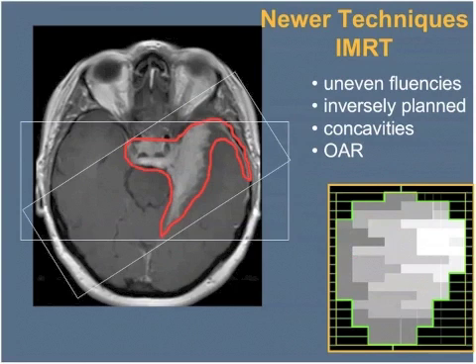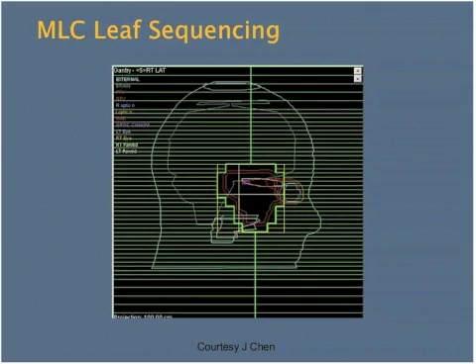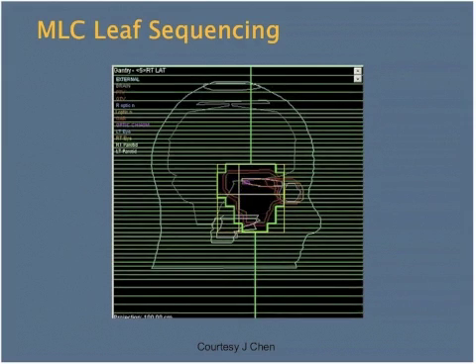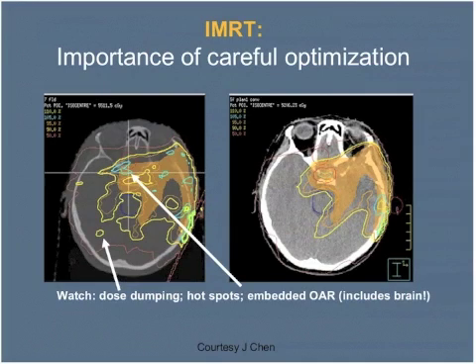the dose is higher. At the anterior area, the dose is lower. And so, for instance, if you were putting a beam in through this region where you're mainly going through tumor, the intensity may be higher than over on this edge of the beam where you're skimming through normal brain. And then this sort of beam is delivered with the multi-leaf collimator, so you can see the beam apertures here will change dynamically through the course of treatment and deliver a differential amount of radiation to different beam segments, and that gives you the summated dose of an uneven fluence from that direction. And when you add up multiple beams of uneven fluence, then you can get very complex dose distributions.